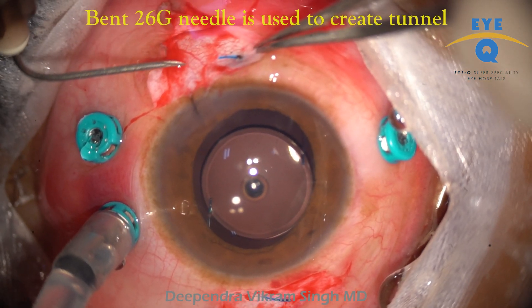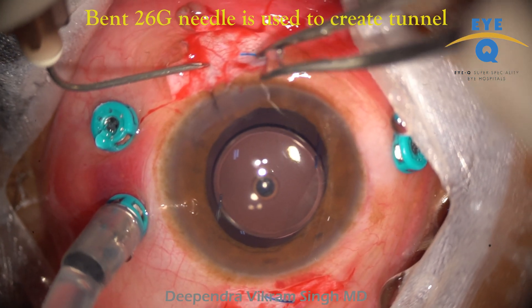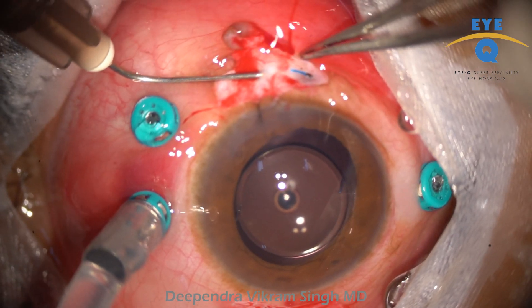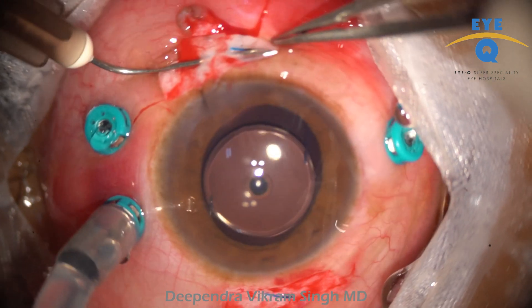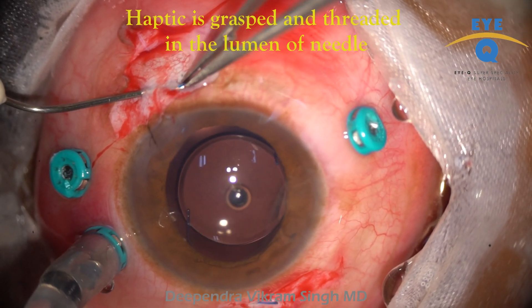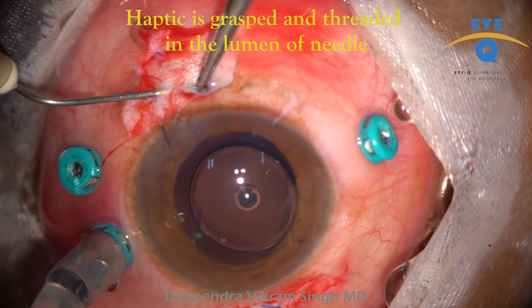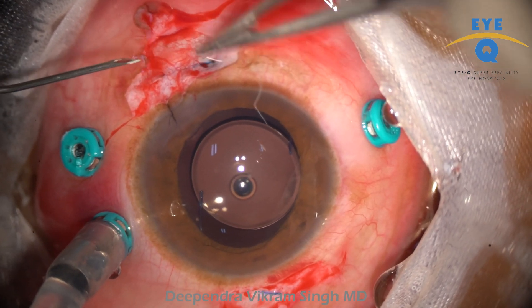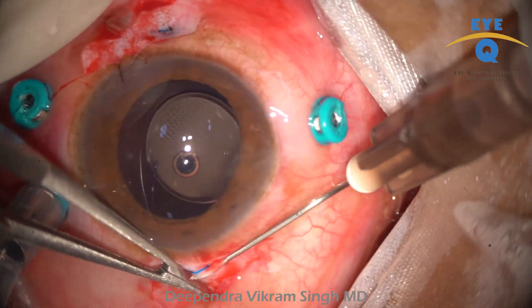A bent 26-gauge needle is used to create a scleral tunnel. Using fine forceps, the haptic is gently threaded into the lumen of the needle. The needle is then gently withdrawn out of the tunnel, with forceps controlling the length of the haptic that stays inside the tunnel.